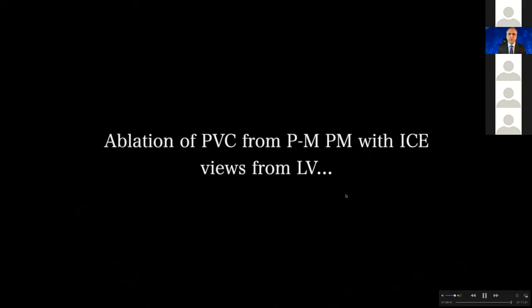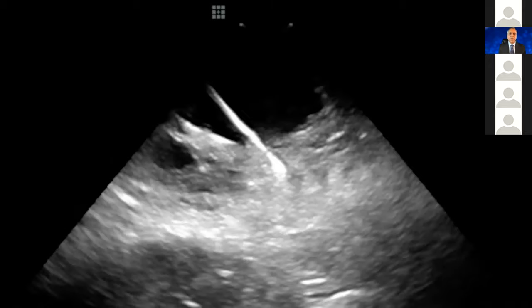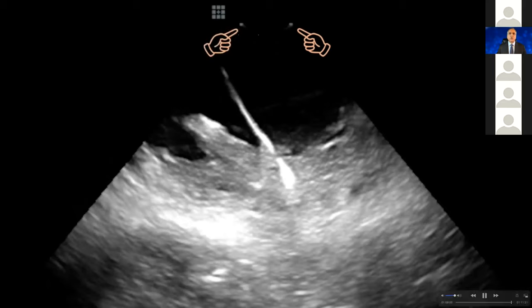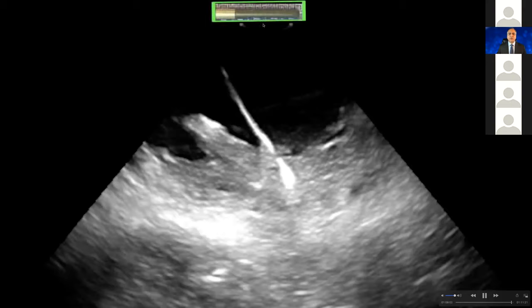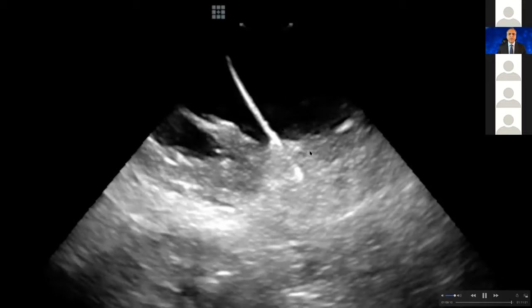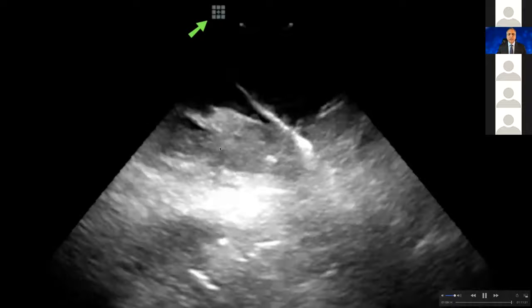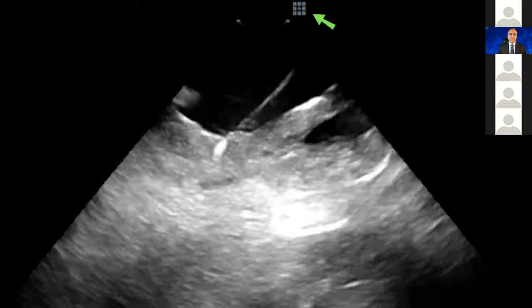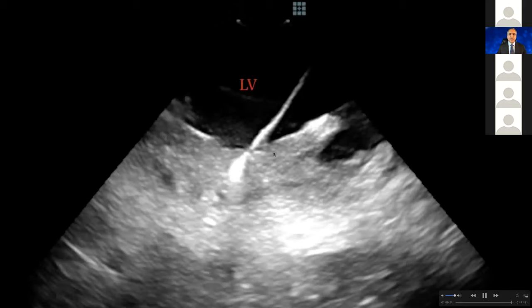This is a PVC ablation from the posterior medial papillary muscle. You can appreciate that my ICE catheter is actually inside the left ventricle — I went through the left atrium into the left ventricle because you don't see any septum in front of the ICE catheter. Here you can see that the ablation catheter is at the distal side of the posterior medial papillary muscle. I toggle the mirror image and you can see the ablation catheter is embedded at the very insertion site of this papillary muscle and the posterior wall, distal to the papillary muscle.